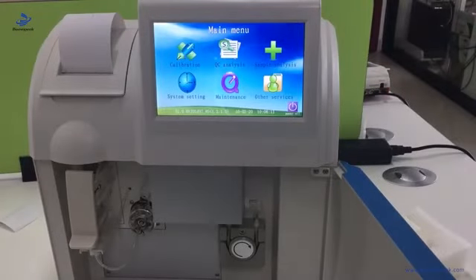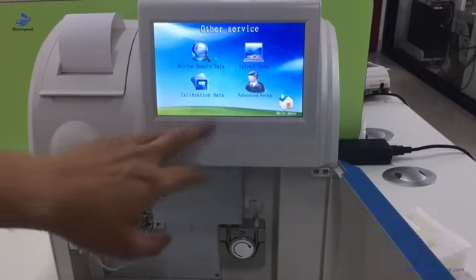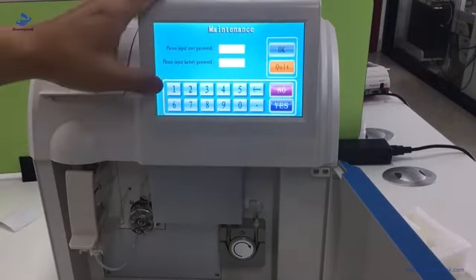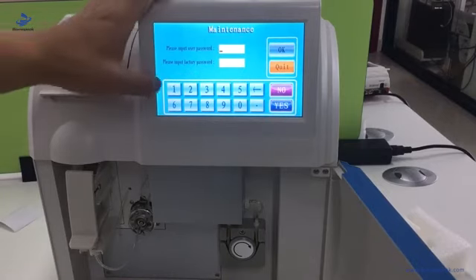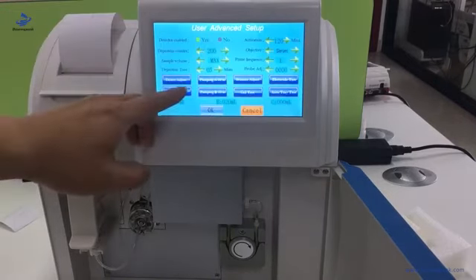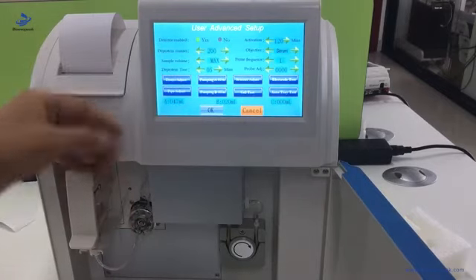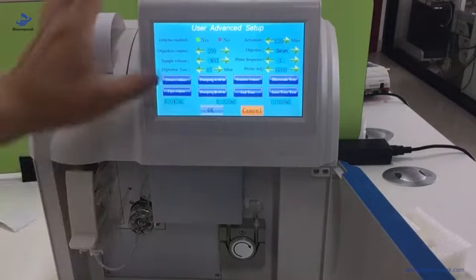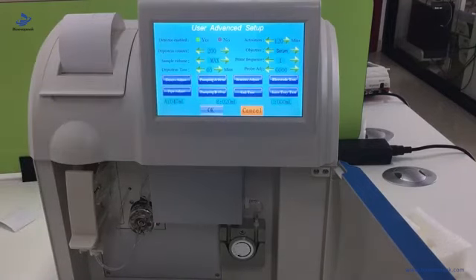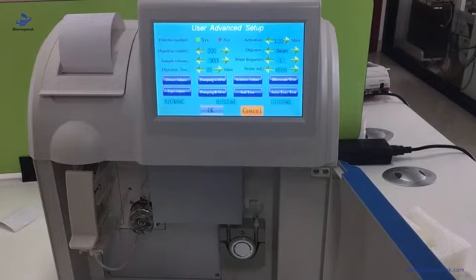Calibration. After first installation, the pipeline is empty, so we need to go to Advanced Setup and enter the user password 123456 to get into the menu. Here we use Piping A and B to fill the pipeline. Before calibration, it is better to run Piping A and B two to three times to let reagents A and B fill the pipeline.